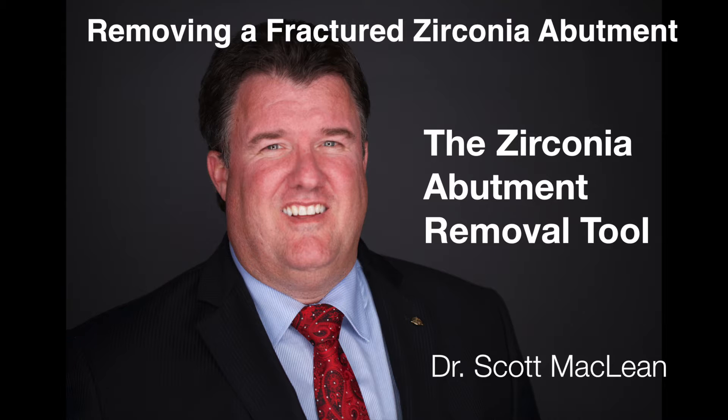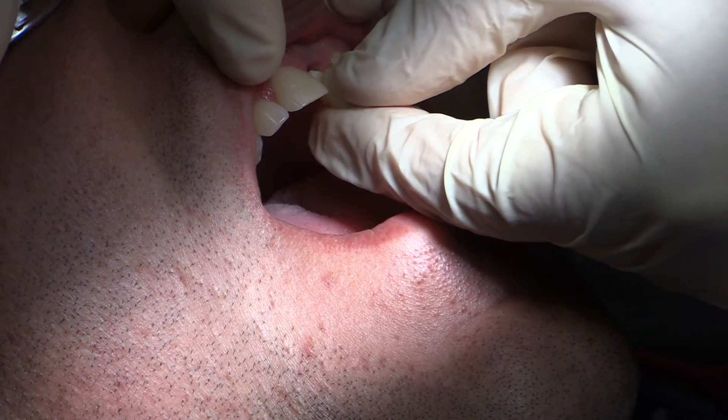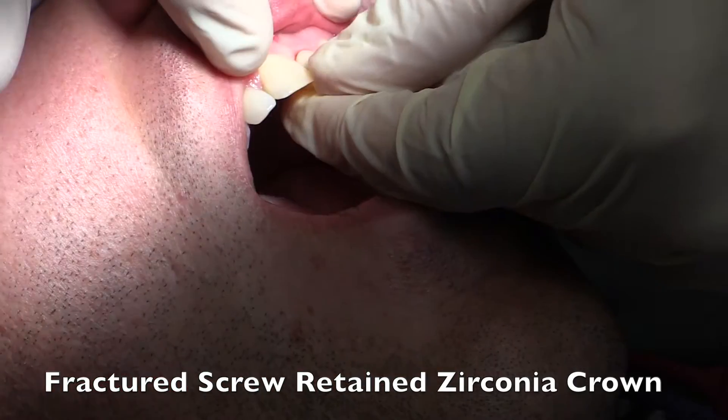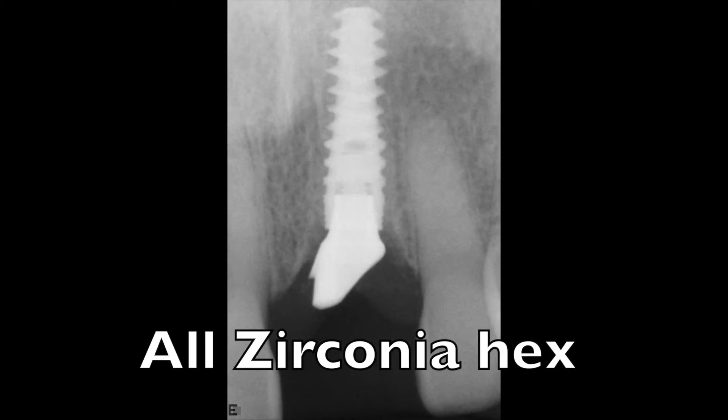The patient presented to my office on an emergency basis, referred from another doctor, with this fractured abutment assembly. This usually happens because the abutment is not fully seated when it's tightened down, and you can have some lateral pressure on the hex. Then the hex gets fractured inside of the implant.